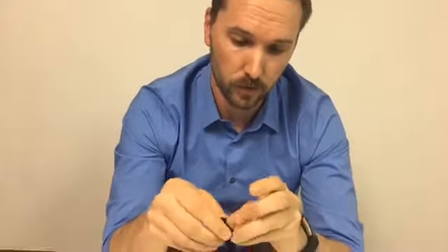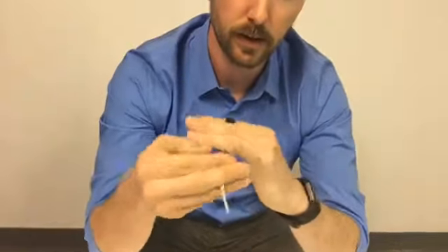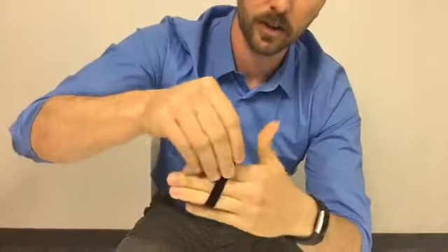You can also wrap it around three different fingers if you need some additional support. For this example, I'll open the loop, stick it around my index finger, and come around three fingers. As you can see, it is long enough to fit around three fingers, so if you really need extra support, you can put it around three fingers.